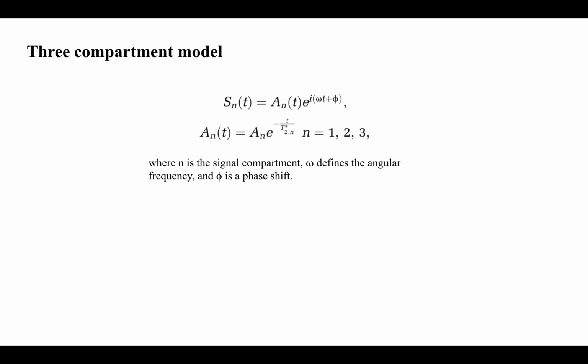Each signal compartment of an image voxel is assumed to be describable using an amplitude modulated plane wave formulation. A 3-compartment model has been used to describe the nonlinear nature of magnetic susceptibility response. We assume field changes as a result of microscale effects are contained in millimeter voxel scales. We opted for a robust method of optimizing for 9 parameters. Thereby, we implemented in MATLAB the global optimization method called differential evolution, which was used to fit the temporal evolution of QSM curves after values were averaged across all participants and each of the brain regions studied.